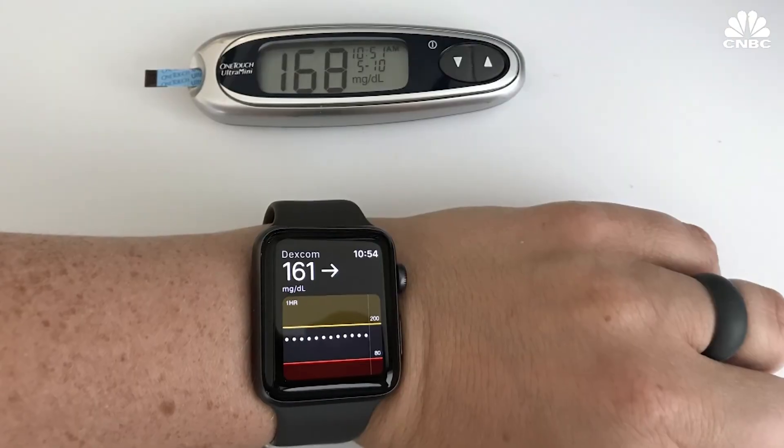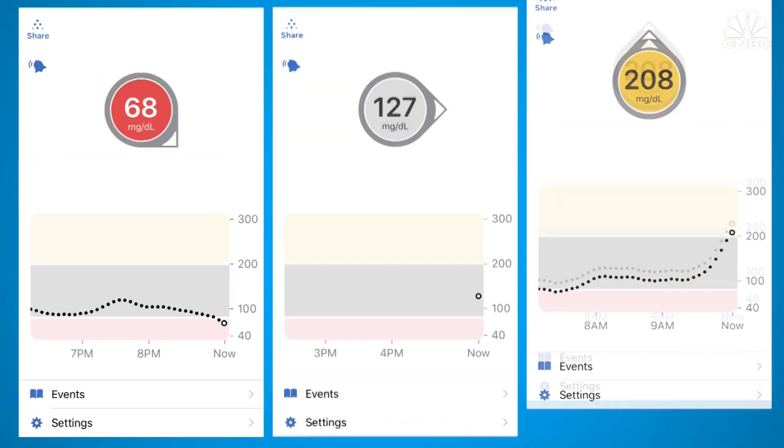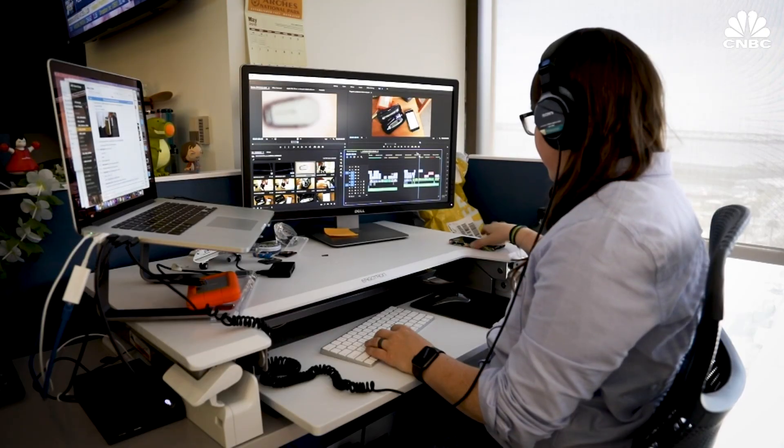By the end of the first day, the numbers did get closer together. And after a few days, the numbers matched almost perfectly. The G6 app has all the same features from the G5 that show you different colors for low, normal, and high blood sugar readings, along with customizable alerts.